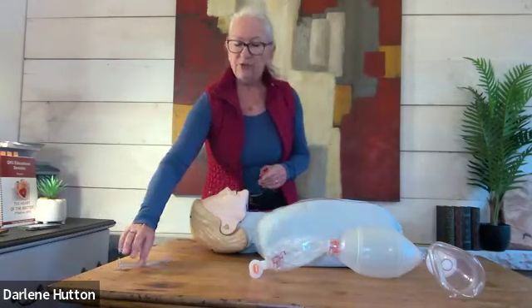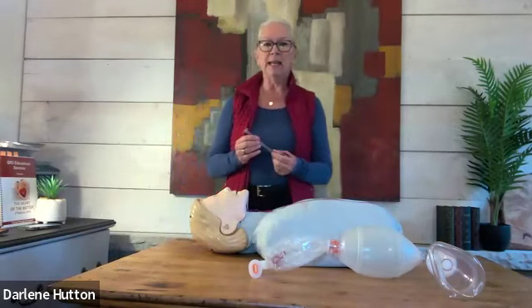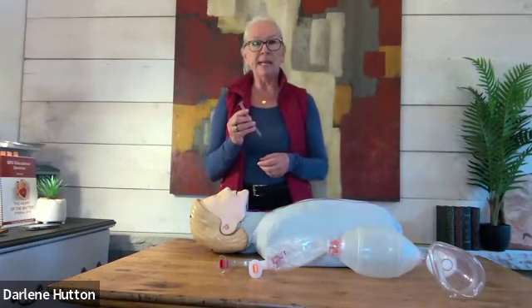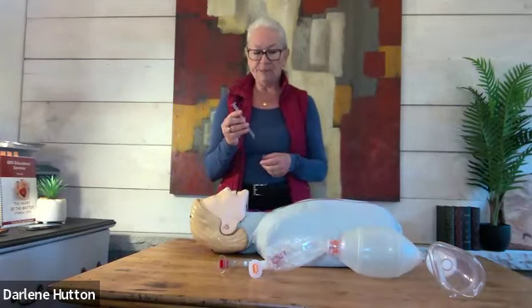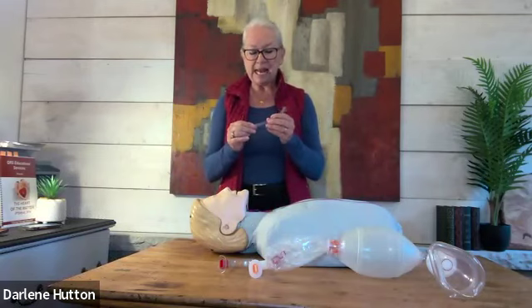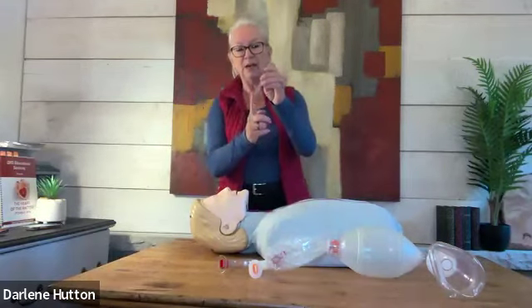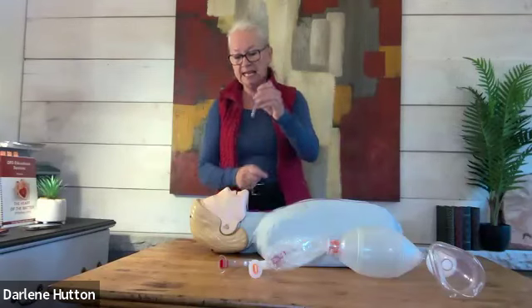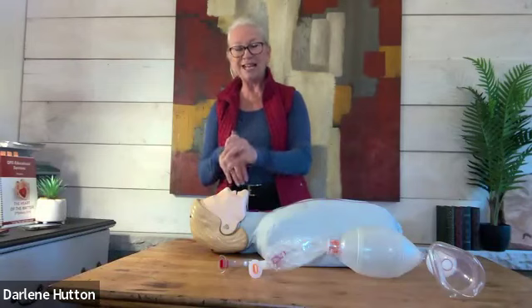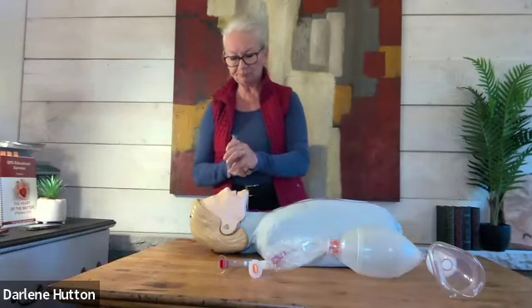If you have a patient who has a compromised airway, yet they are still conscious, the alternative would be a nasopharyngeal airway. When inserting this into the nostril, you lubricate it first, and you want to ensure that the beveled edge, the angled edge, is going towards the septum.